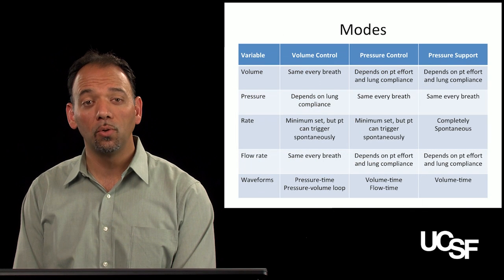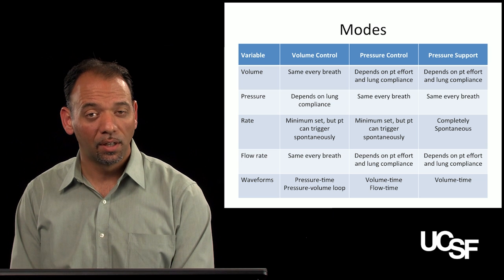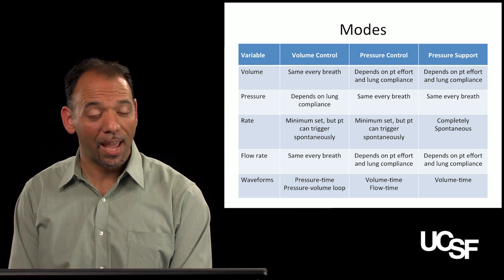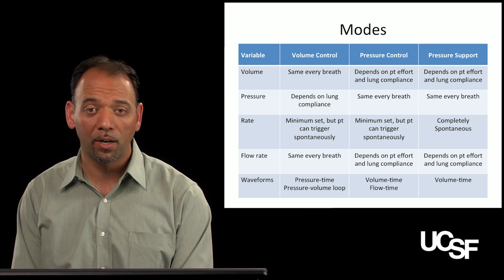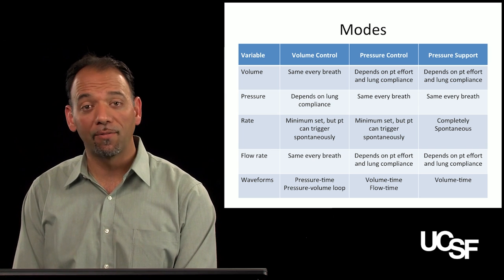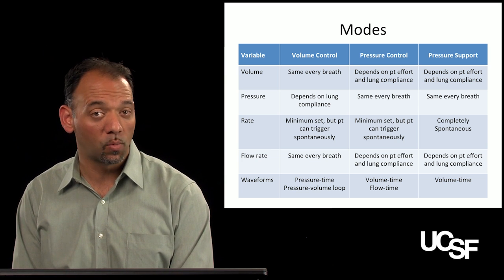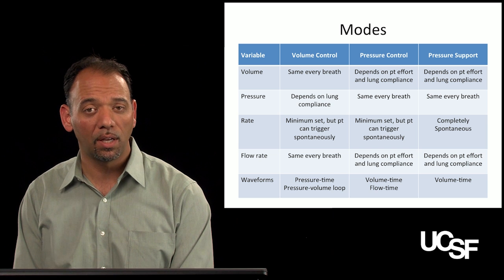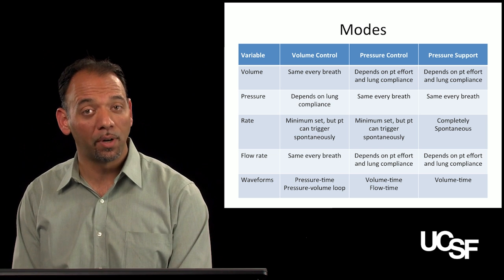They can take a huge tidal volume, and they do that by achieving a much higher flow rate, which when you think about it is the way that we breathe normally, with negative pressure ventilation. When we're out running, or running up the stairs, or running a marathon, we can augment the effort that we give per each breath. We do it based on our own needs and what we want. You can do that in pressure control, which is why some people think, and it's borne out when you look at the patient, that pressure modes are a more comfortable mode to breathe on.